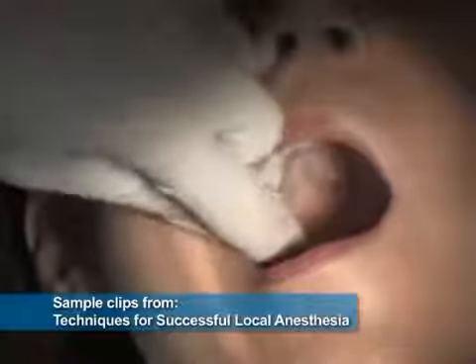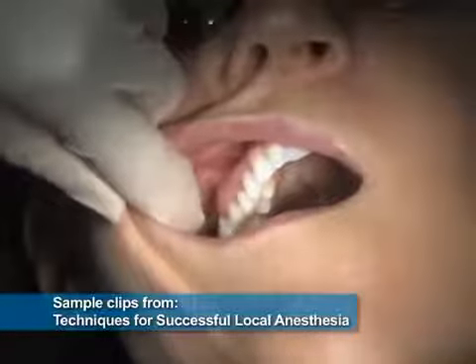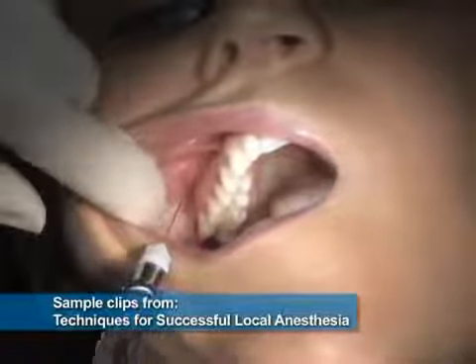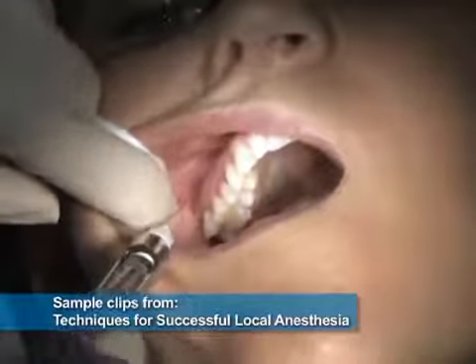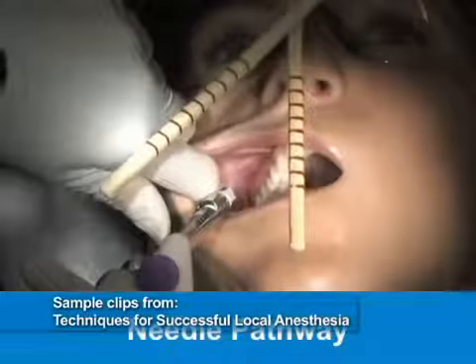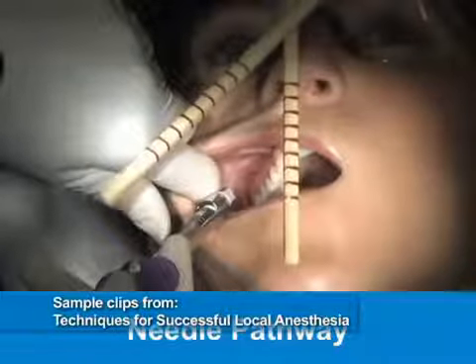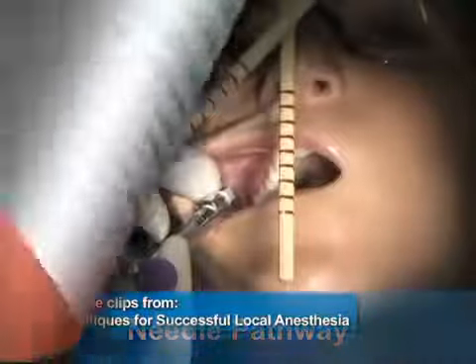The posterior superior alveolar, or PSA, is a nerve block injection that anesthetizes the pulpal and osseous tissues, periodontal ligaments, buccal gingiva, and adjacent vestibular mucosa of the first, second, and third maxillary molars. The pathway of the needle is at a 45-degree angle to the occlusal plane and a 45-degree angle to the mid-sagittal plane of the maxillary molars.